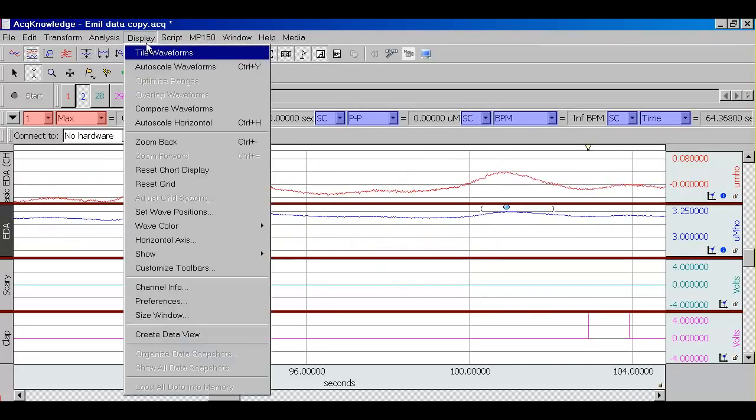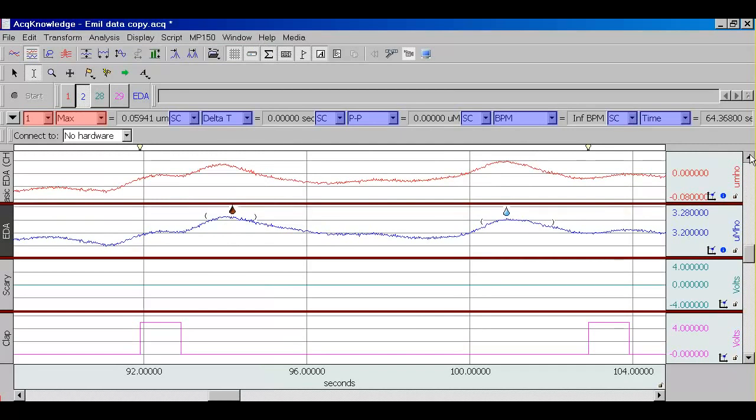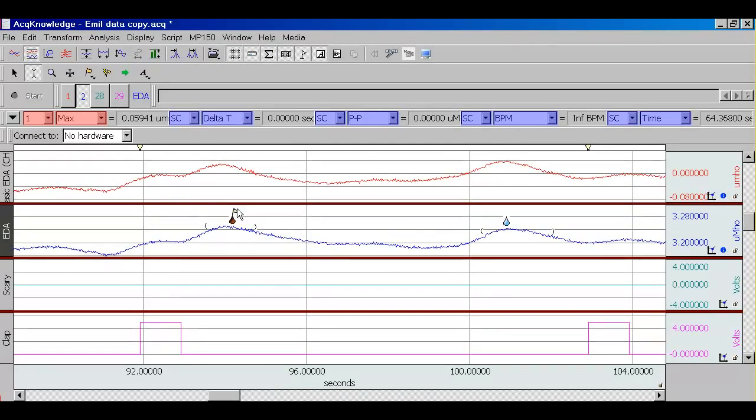And then if we scroll further, we can see an event that is marked as a specific skin conductance event. It has a little flag on the sweat drop, and it's also red. As you can see, it follows a stimulus presentation, but it follows it within the time period that we had specified in the settings. So this one, for example, has occurred too late after a stimulation event.